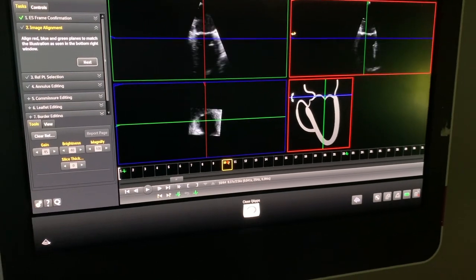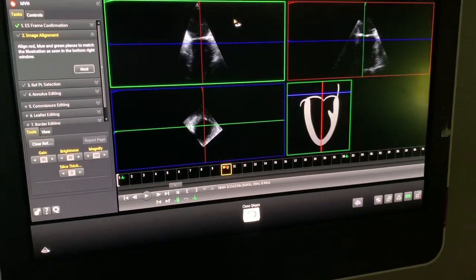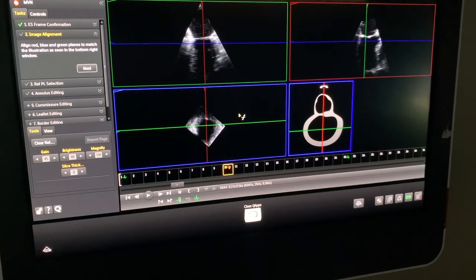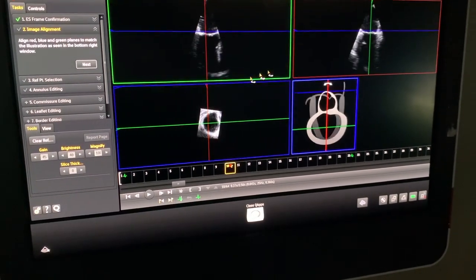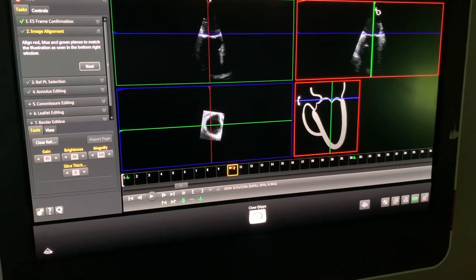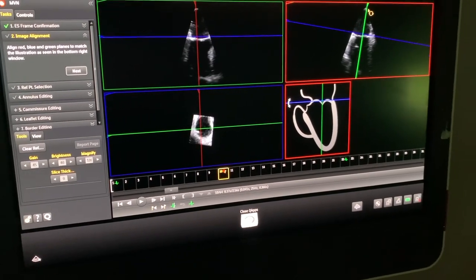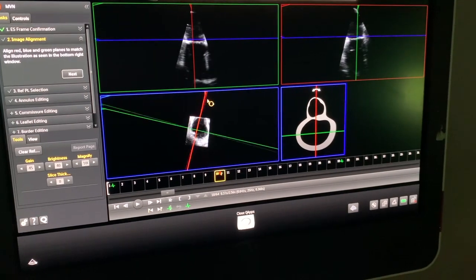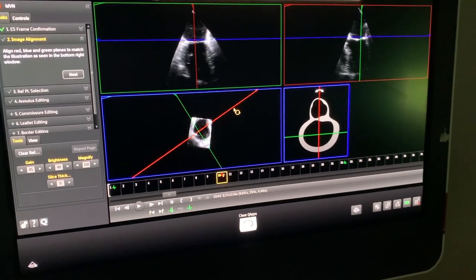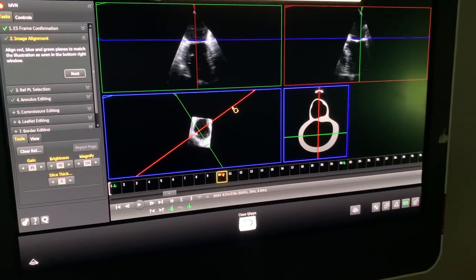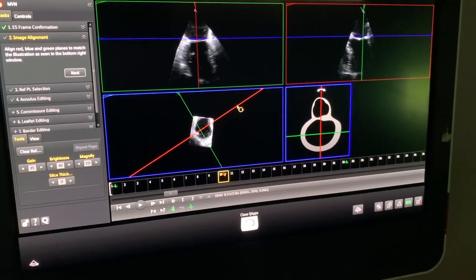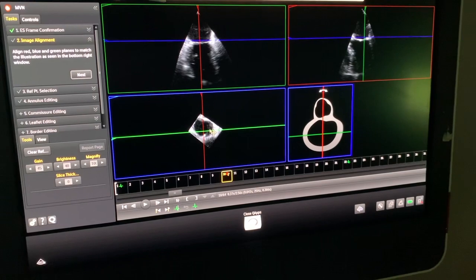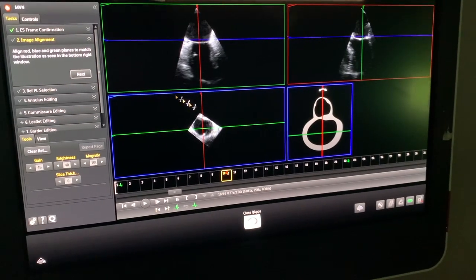You notice the right upper screen is where we need to have the three-chamber view. Initially, what we do is we align the purple line — the horizontal line — with the mitral valve annulus, and then rotate the short axis view in order to achieve the three-chamber view in the right upper quadrant. Here, we're just adjusting the purple line.